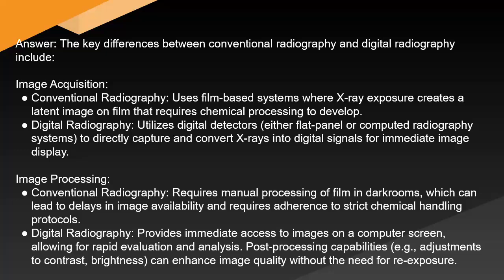Image processing: conventional radiography requires manual processing of film in darkrooms, which can lead to delays in image availability and requires adherence to strict chemical handling protocols.